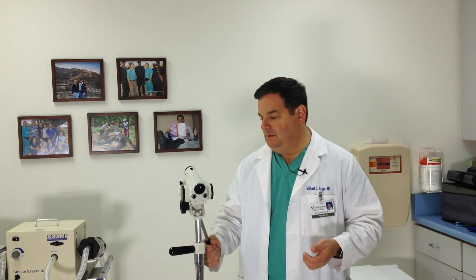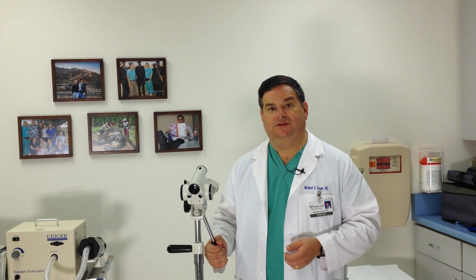This is a colposcope, and it's what we use for what's called colposcopy. Colposcopy is a word that means microscope of the vagina, or looking at the cervix with a microscope. This is the little microscope that we use to look at the cervix.